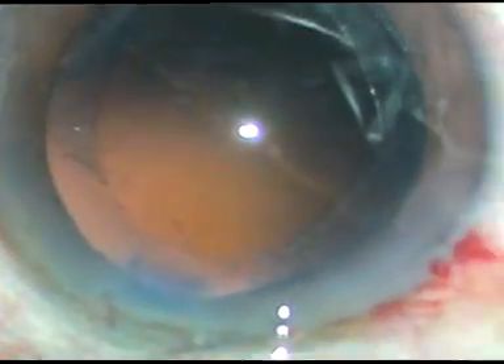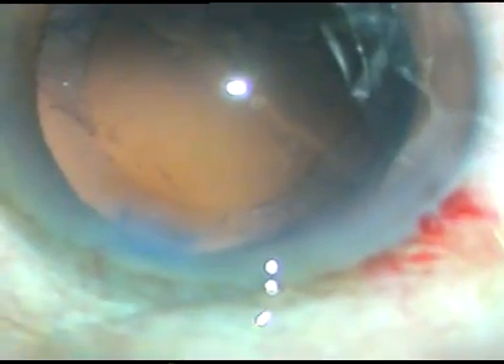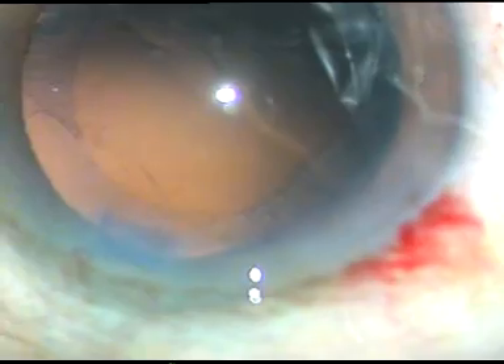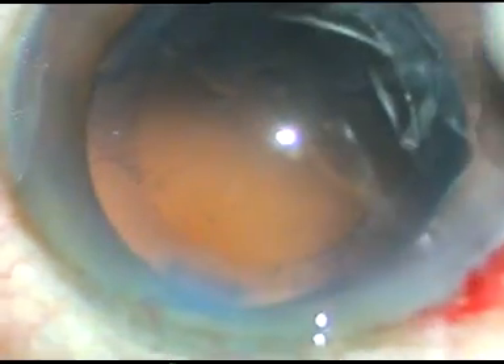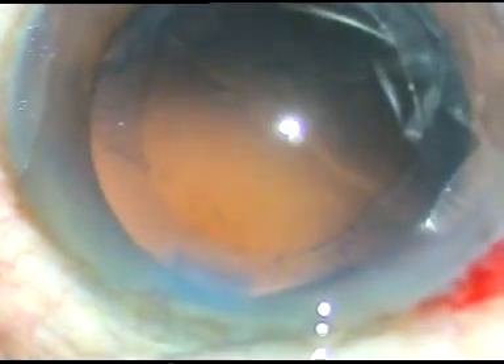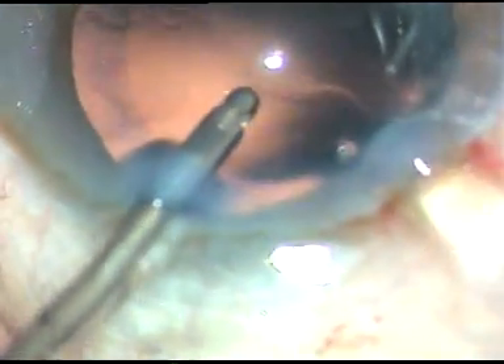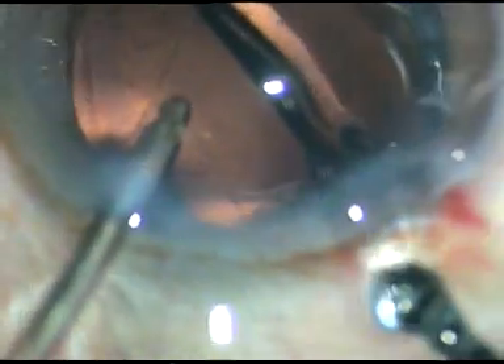I have made a PC rent while polishing the posterior capsule with bimanual IA and Simcoe cannula. I have a lot of experience in causing rents and managing those.